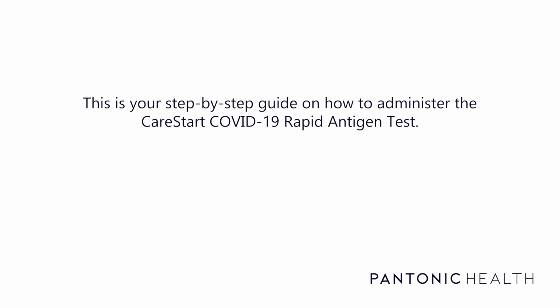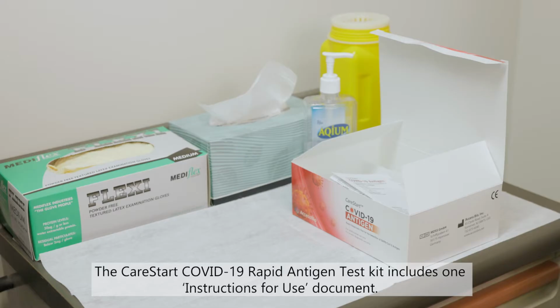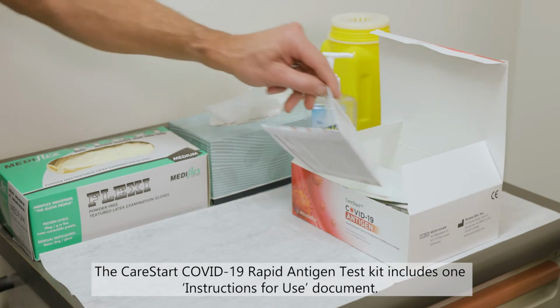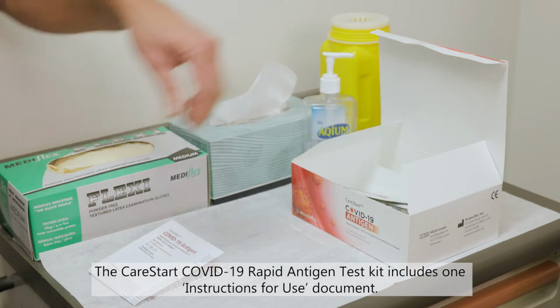This is your step-by-step guide on how to administer the CareStart COVID-19 Rapid Antigen Test. Please comply with the latest Therapeutic Goods Administration (TGA) conditions for the use of the Rapid Antigen Test as advised by Pantonic Health. The CareStart COVID-19 Rapid Antigen Test Kit includes one Instructions for Use document.